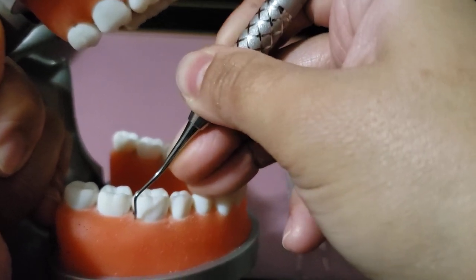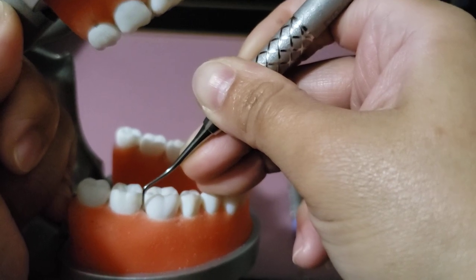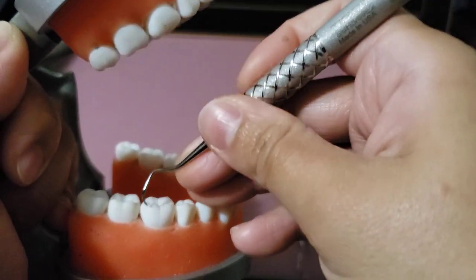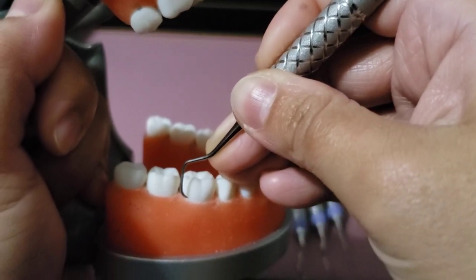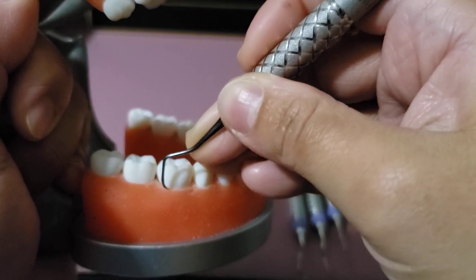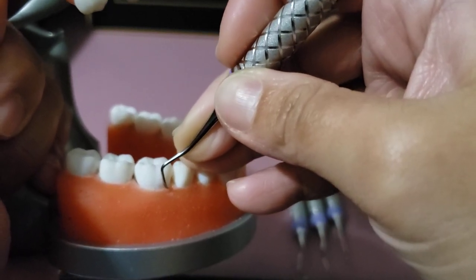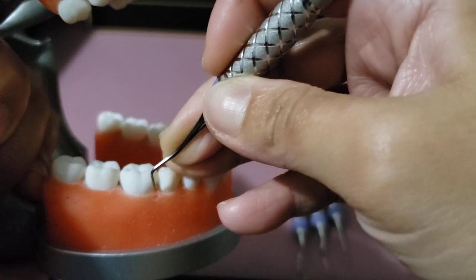Starting at the distal line angle, close, insert, open away slightly, and rock using overlapping strokes until fully in the proximal. Pull away the instrument, then point it mesially. Starting at the distal line angle again, close, insert, open away, and work the mesial surfaces, rolling in the line angle until fully in the proximal.